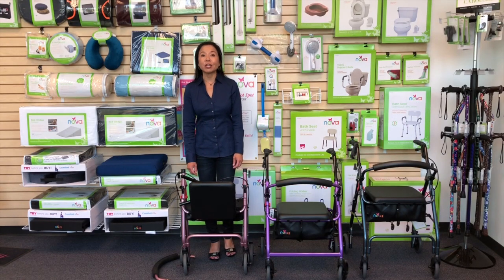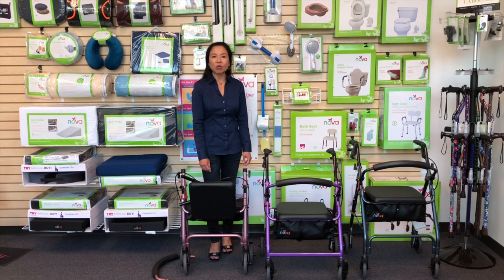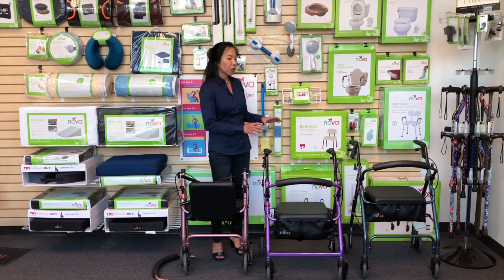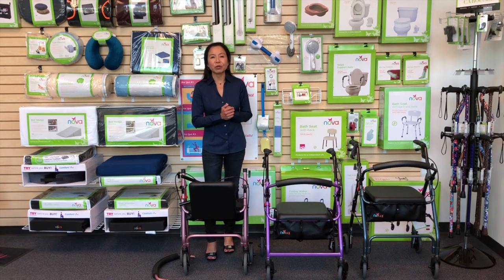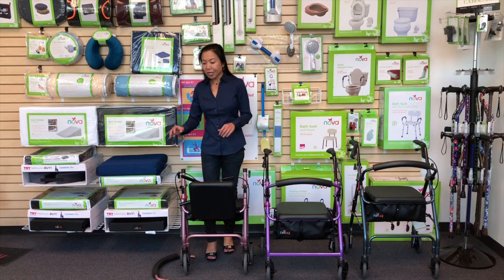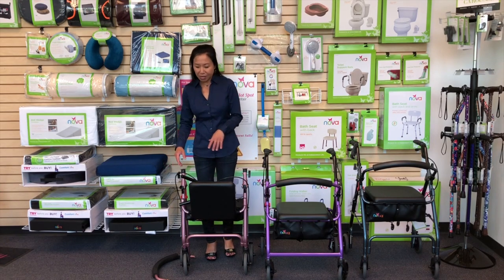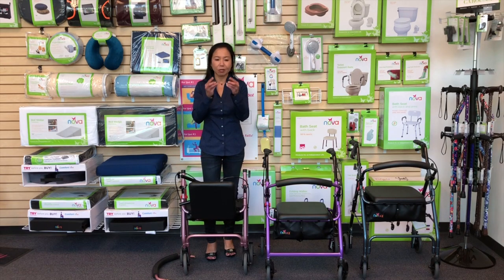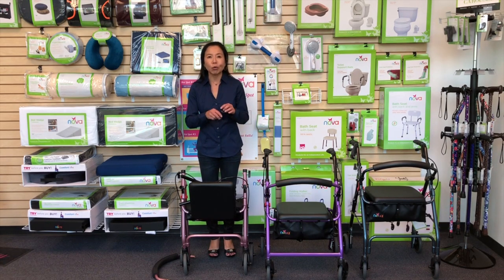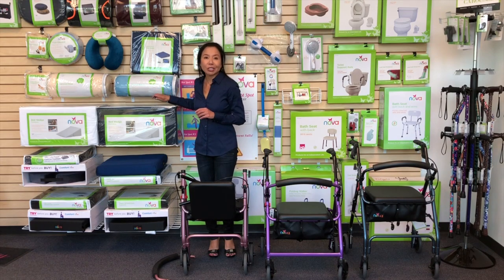This video is about the Nova GetGo series rolling walkers, and that includes the GetGo Petite, the GetGo Junior, and then the GetGo Classic. So go ahead and take your Nova GetGo out of the box, and that'll have the walker and the backrest. And once you get out of the box, you'll find these rubber stoppers. They look like little rubber hats.